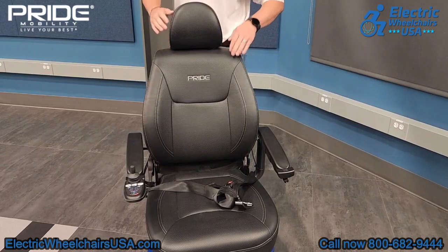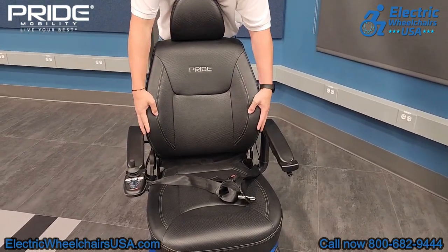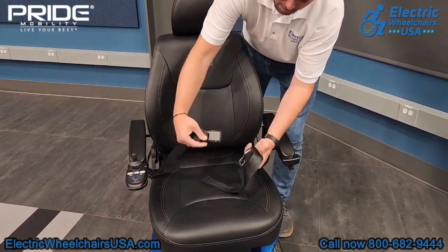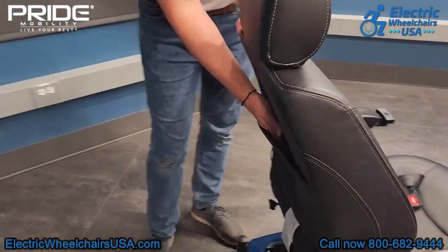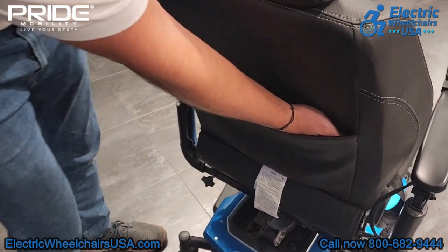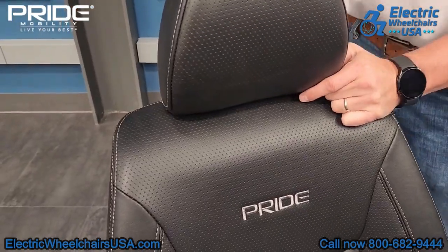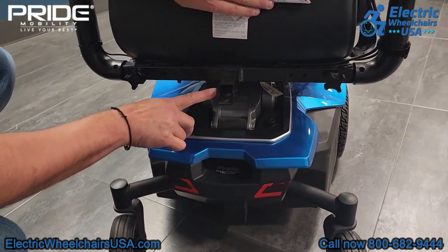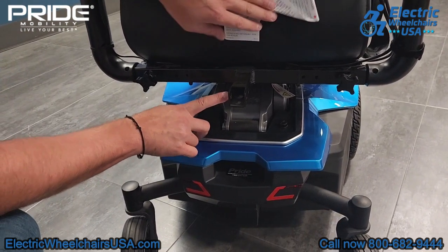The seat on the Jazzy Air 2 is very well made. It has a breathable material with stitching, similar to a luxury car seat. It also comes standard with a seat belt. On the back of the seat there is a large storage pouch so you can store things like your wallet or even your charger. The headrest is also adjustable up or down for added comfort. On the back of the seat there is an accessory hitch — you can add things like a rear basket. Just go to our product page to see which accessories are available.